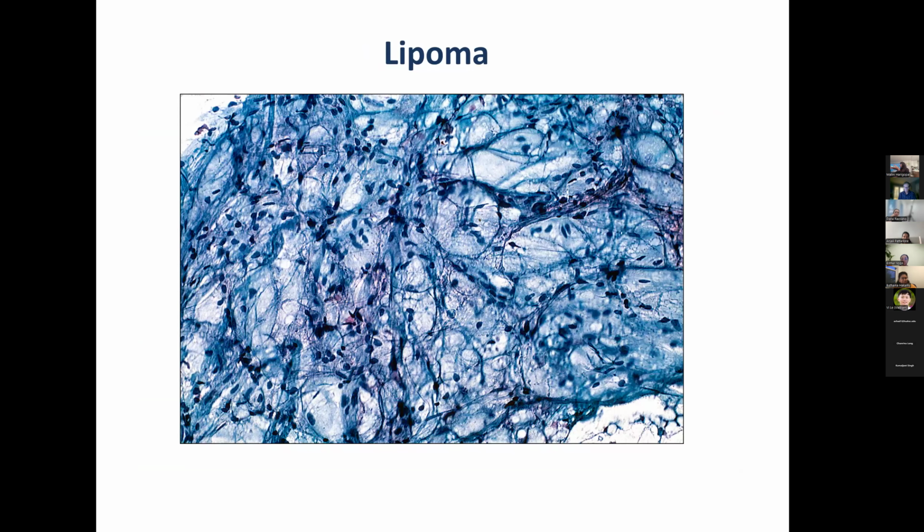Lipoma in a breast is difficult to diagnose. Again, you need imaging and other clinical features because breast is a fatty tissue, so it's really not a classic diagnosis.